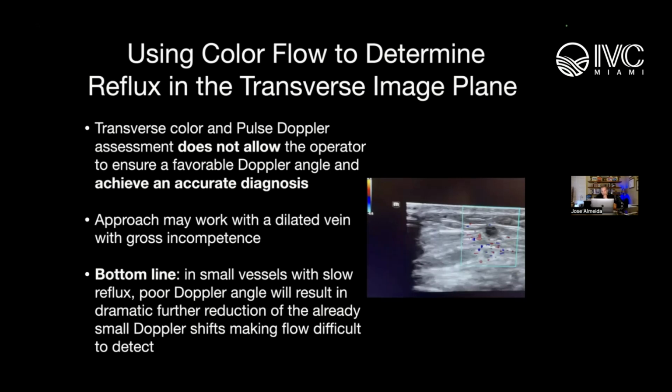Sometimes my techs won't detect flow on somebody with C2, and I'll just kind of go up and down and squeeze myself. And sometimes I'll find reflux they didn't, or vice versa, but it'd be rare. But usually theirs is more accurate. The longitudinal is more accurate than the transverse. Is that the point we're trying to make here, for detecting flow? Yeah, for sure.